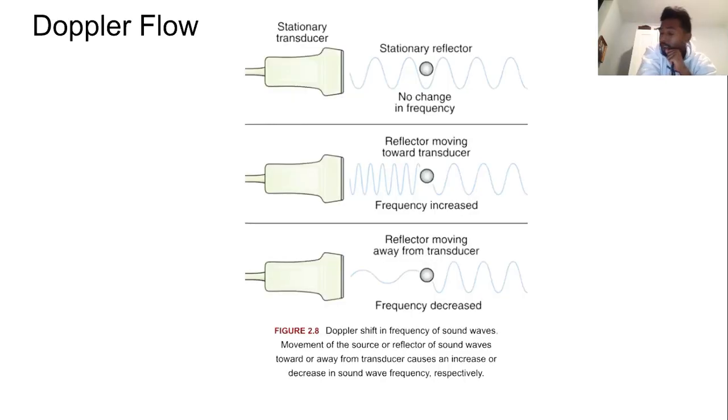All right. Next, I'm just gonna touch lightly on Doppler flow, and then I'll talk about it more when it comes up. So Doppler flow is basically... Do you know what Doppler flow is, Kenny? I learned it once. I kind of know it. Take a shot at it. It's like, I forgot if it's going away from you or something. If it's going away from you, I think the frequency is less, and when it comes back, it's higher. Exactly.